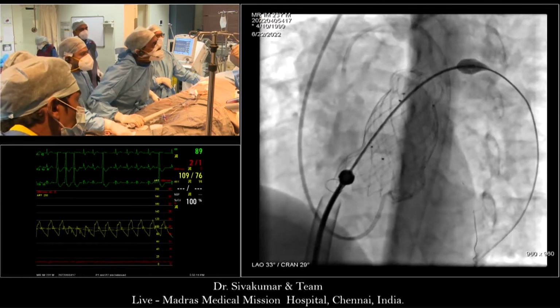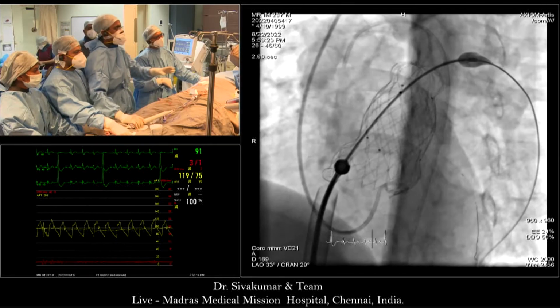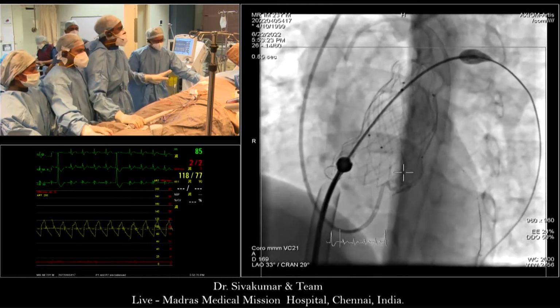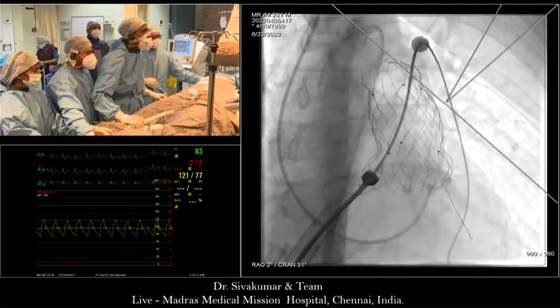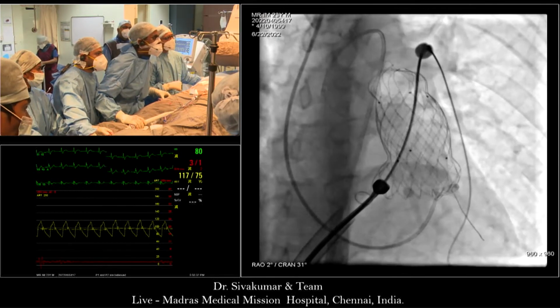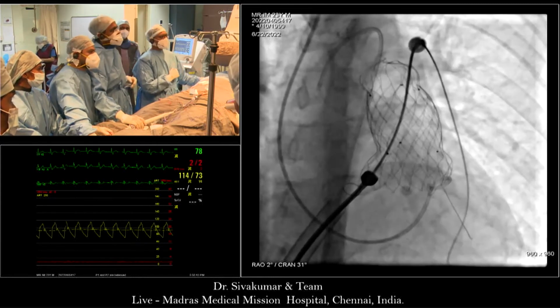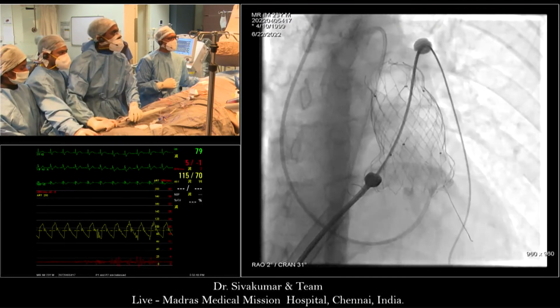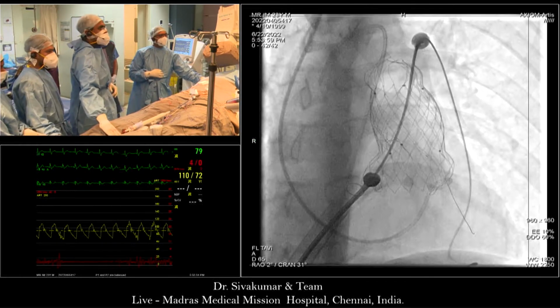Is that right, Shaq? Yeah, one's just covered, but if you look at the other plane as well now. Okay, come to AP cranial. I have one. See, I have one at around 3 o'clock, lateral, and one just next to the attachment point. Exactly. I agree. So now, let me come to RAO. I will try to take the carrot out.